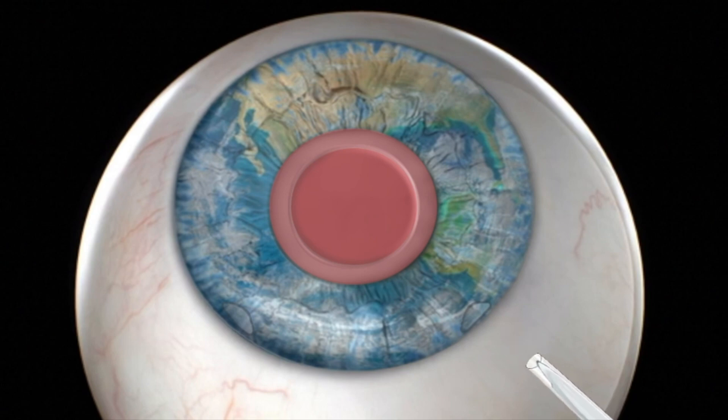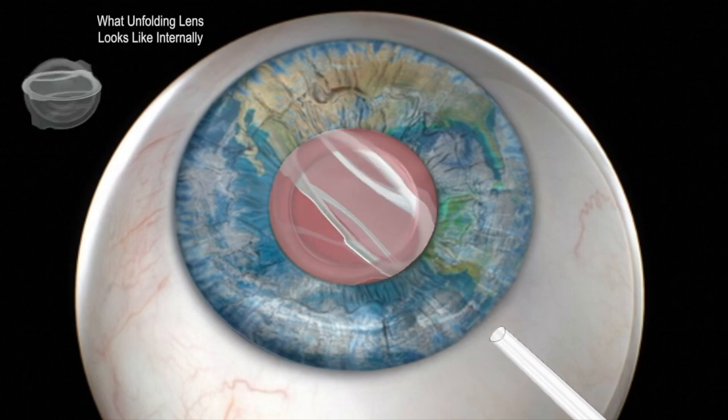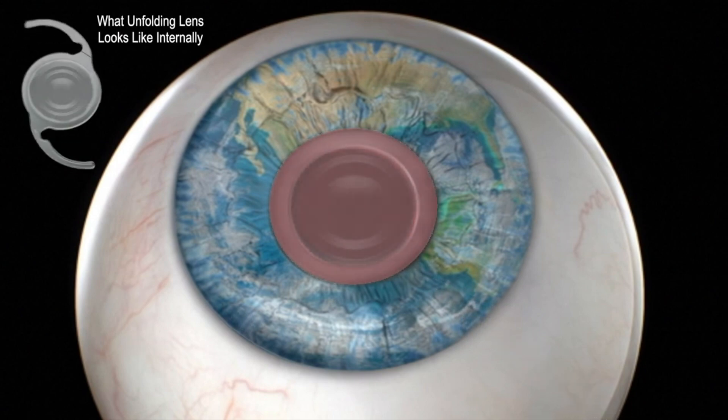Finally, the clear artificial lens is implanted using an injector. The intraocular lens spontaneously unfolds inside the capsular bag and remains centered and fixed, resulting in clear vision. The incisions are self-healing.